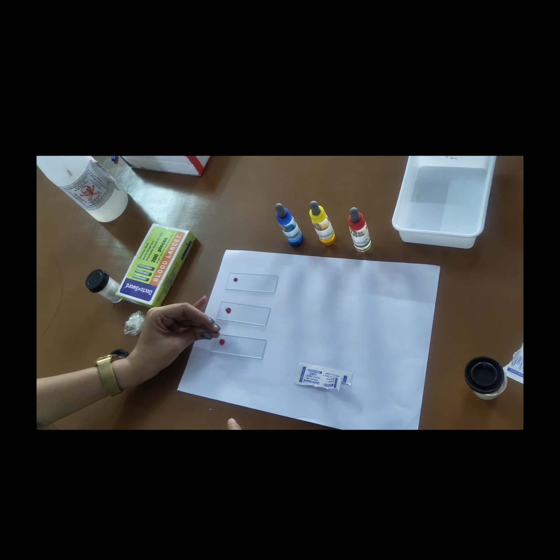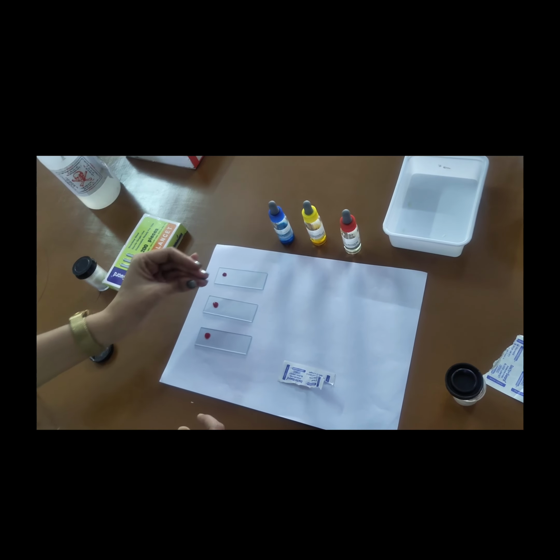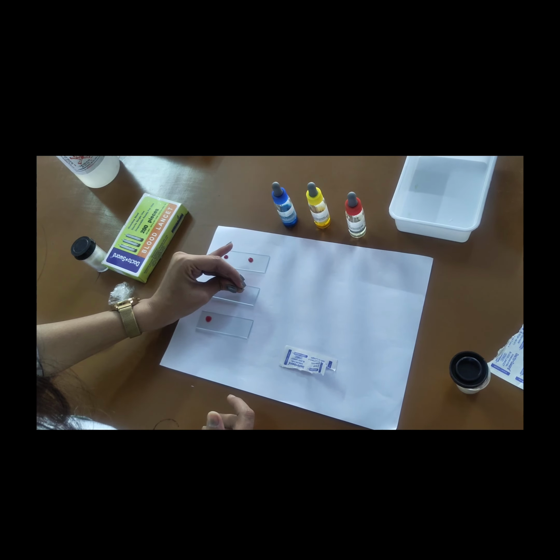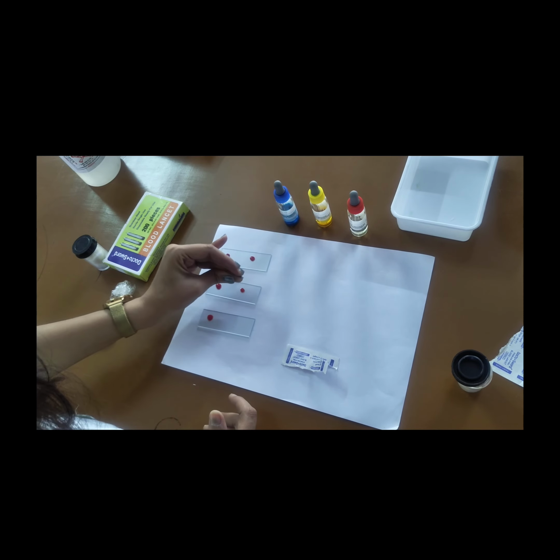Here we have taken 2 samples on each slide for easy understanding. You can do with only 1 sample on each slide.